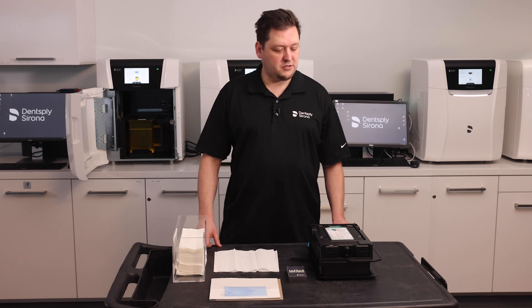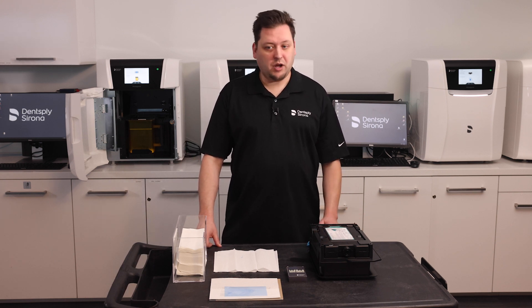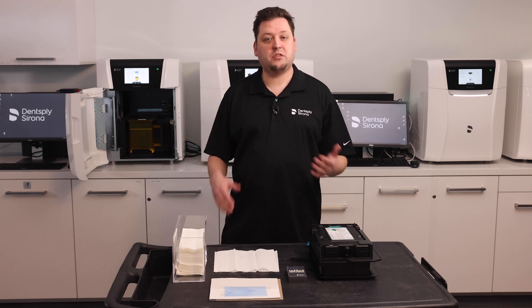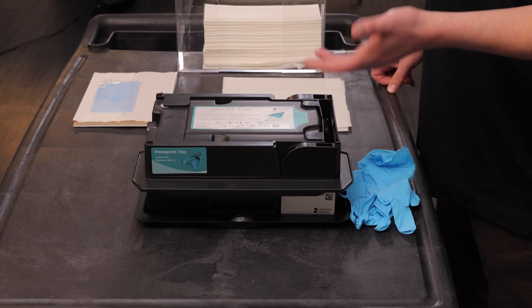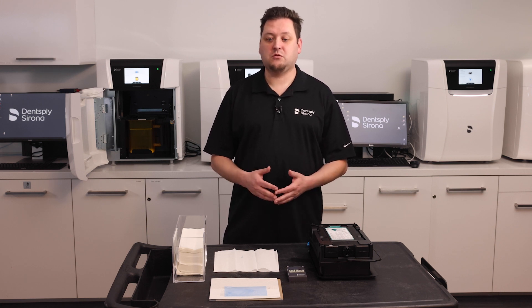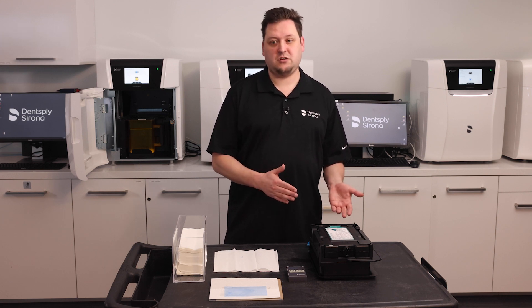Hello. Today we're going to discuss a rare situation that could happen and how to remedy it. The prime print is sensitive enough that if it detects any object interfering with the build plate — the way it contacts inside the foil in the material unit — it will notice that the object is there and display an error code. If that happens, you must remove that object, which will be either on the build plate itself or within the material unit.